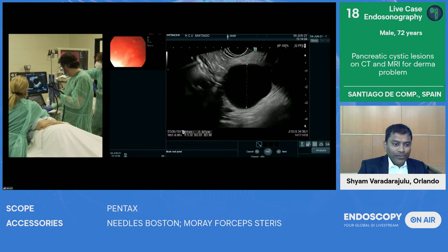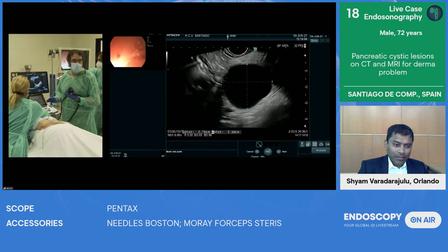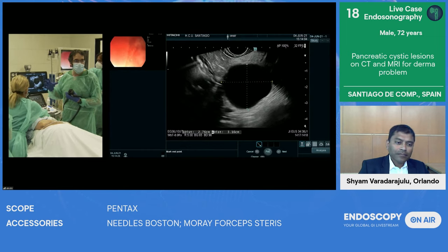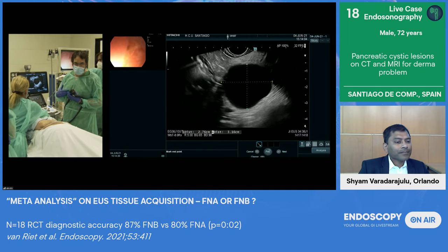And Julio, are you using a regular linear scope or is it a slim scope? I'm using the standard, the 38J10, the new therapeutic scope, 4.0 channel from Pentax. But it's true that I tend to use a very enlarged image because I love to see everything big when I'm in front of what I'm seeing on the screen. And this is one of the good advantages of the new 850, that the quality is very high, even if you are very zoomed in on the screen.